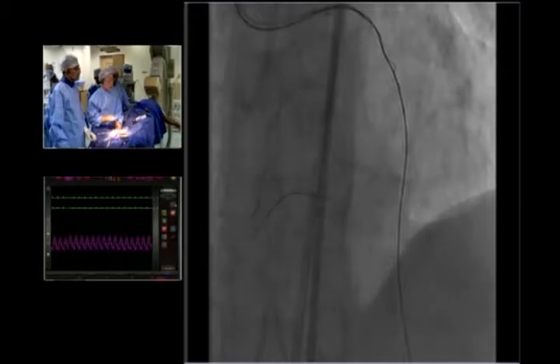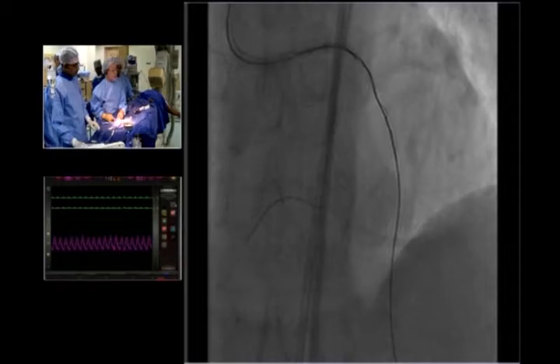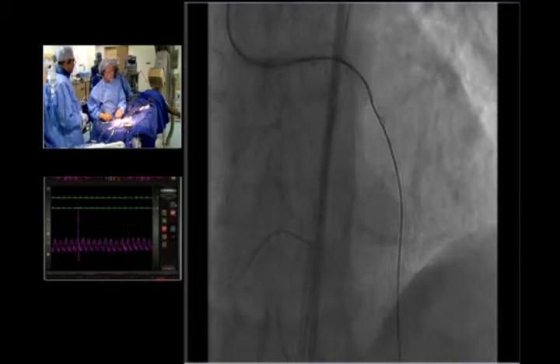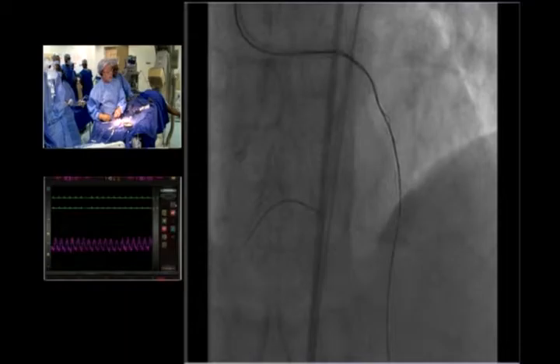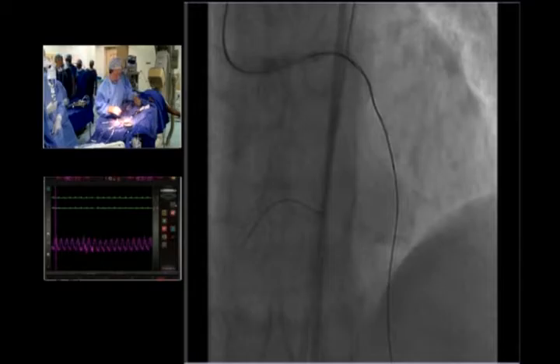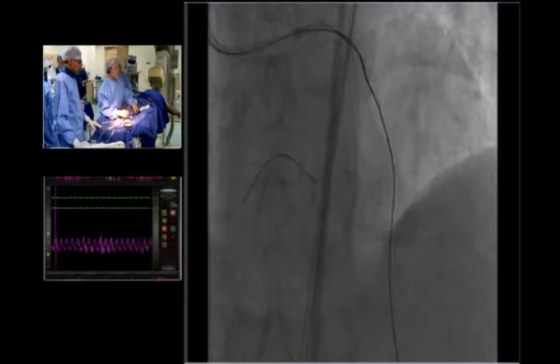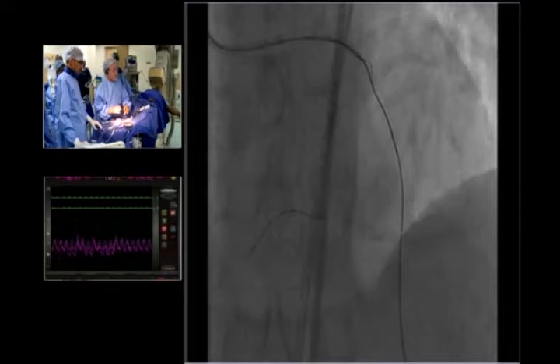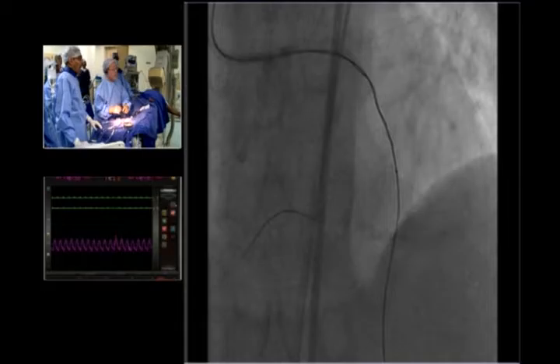I cannot advance XTA anymore because of the tight grasping here. Okay, then I will try to move the wire in the Tornus. No, cannot. Can I see one more magnification? Okay. Can I see the cranial? Can you move the table? Okay. I want to see everything. The magnification. Okay, I will try to pull back the wire. It's easy. So then I try to... No. Completely trapped. Remove the Tornus again.